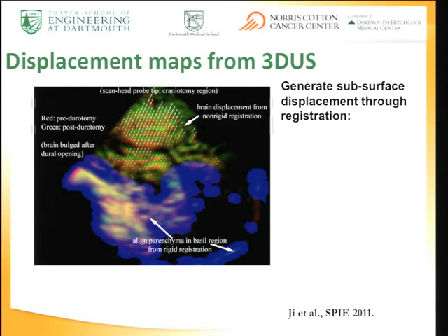Those of you who might have seen it. So here's the information. We take this mask to define what we're going to use as stationary information to try to reduce the tracking error, make that rigid registration, and then you can still see the misalignment here. That's that registration, the nonlinear or non-rigid registration, to produce these displacement maps.